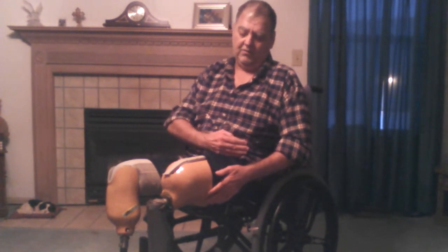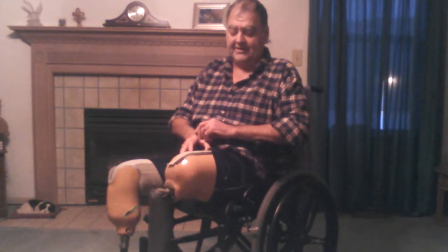My stump has shrunk down a little bit since I got this shell, so now I have to put several socks underneath it to kind of fill in the space, so what's left of my leg does not move around and become painful within this shell as I'm walking. I'm going to show how I take this thing off and the process and why.